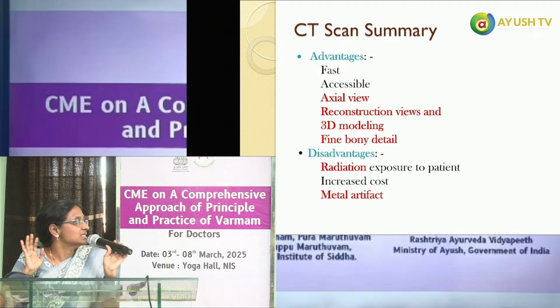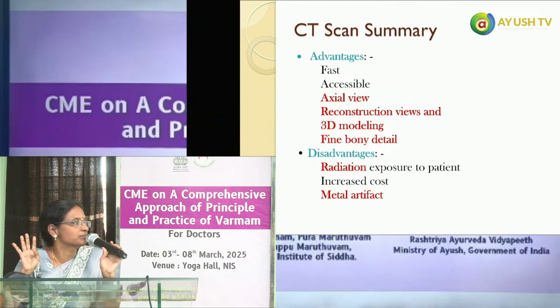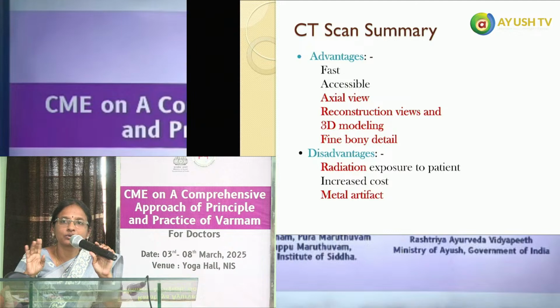So to sum up, CT is fast and accessible. The take home points will be axial views, reconstruction, 3D modeling, and excellent bone details. The disadvantages, as we all know, are radiation, it is definitely expensive, and metals must definitely not be present.